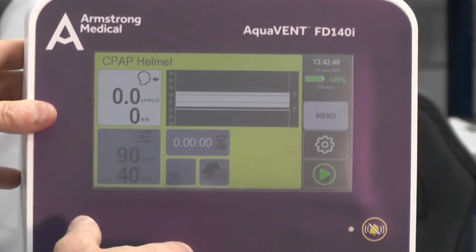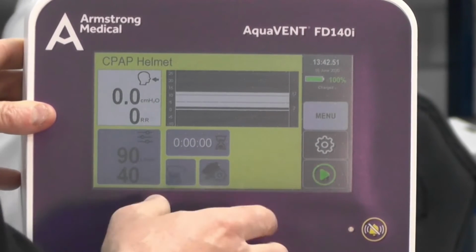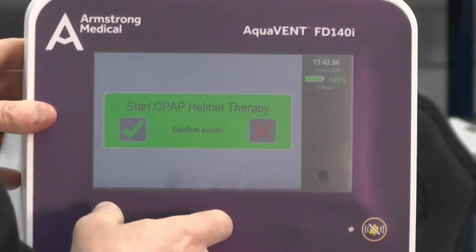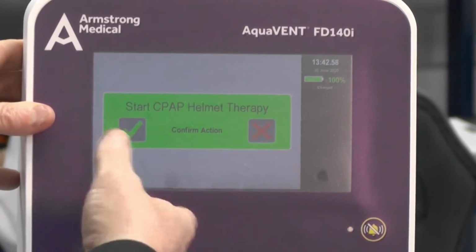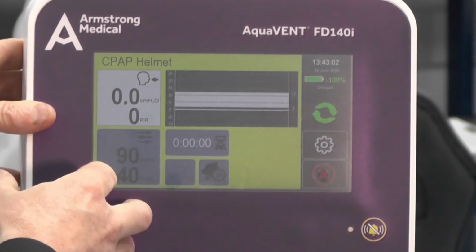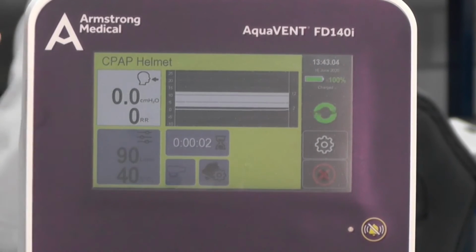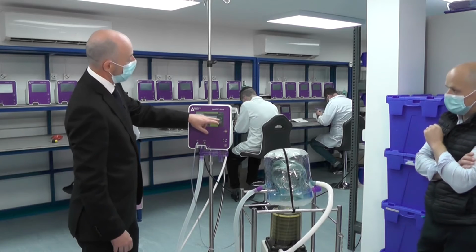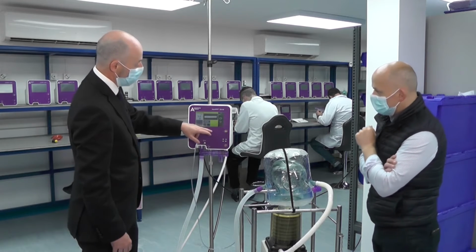You press OK. You're then presented with a green forward arrow, so you want to press that. It does tell you, finally, do you really want to start the therapy? In which case we say yes for the green tick, and therapy starts. Therapy is indicated with a rotating pair of green arrows.